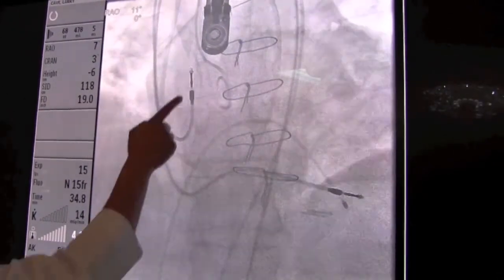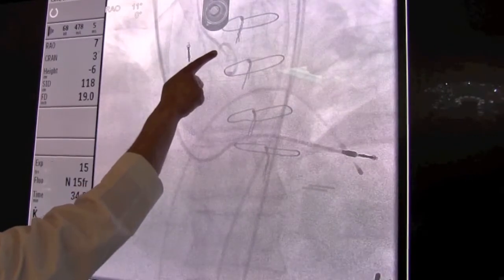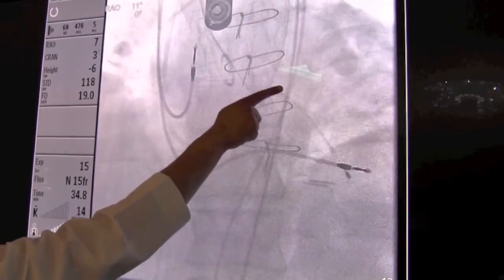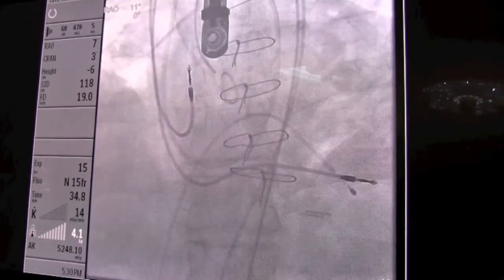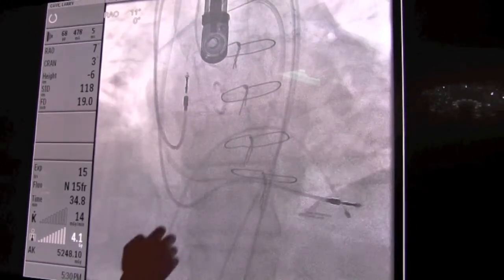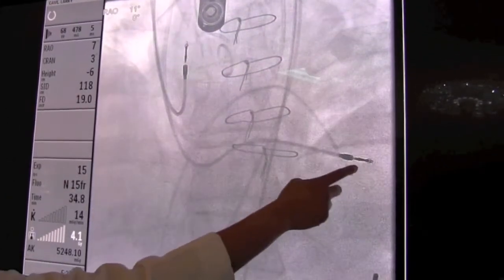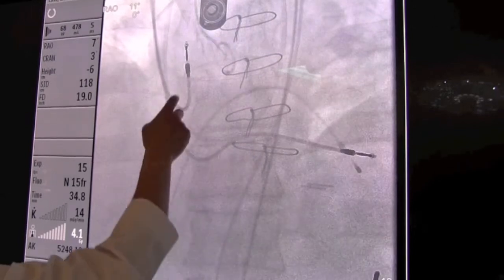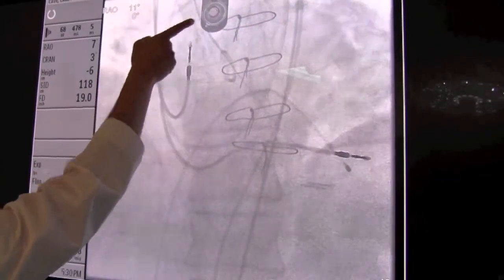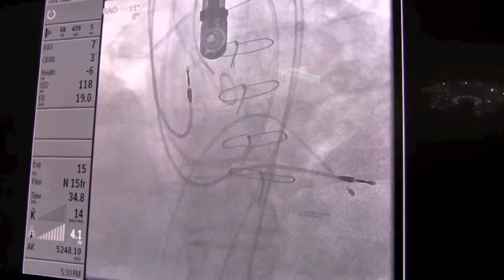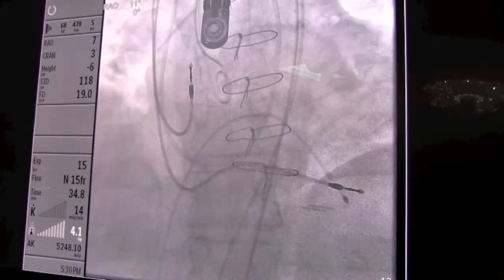Here we're trying to cross the aortic valve, so we use a special catheter which directs us to the valve — and there we go, we cross it. That wire is now in the aortic valve. This is our pacemaker wire. The patient actually has an old pacemaker with leads already in place, and that is the transesophageal echocardiography probe, through which we can watch the valve, sitting in the patient's esophagus.